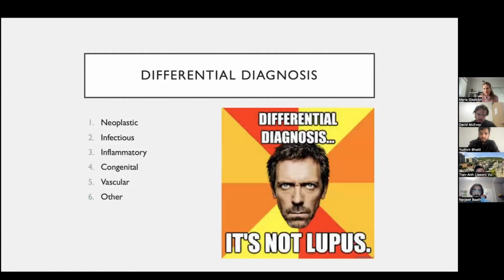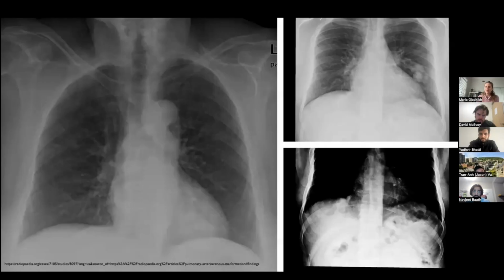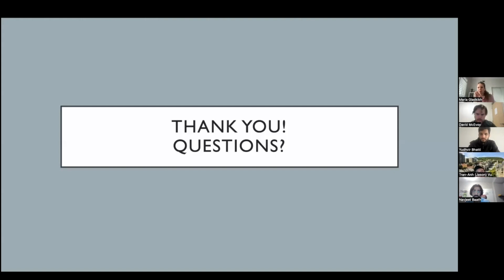But again, at this stage, I think the primary thing for you to be able to do is to describe the location of the lesion and characterize it, and just use your descriptive terms, because differential diagnoses, I think, will come with time. You just can't possibly know it all right away. I think that is it.